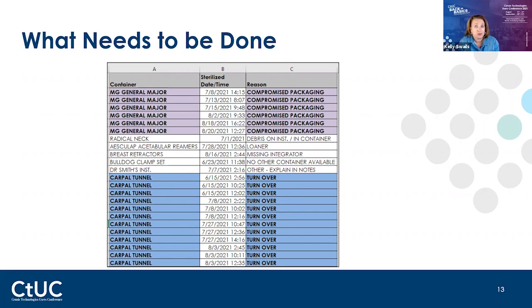But back then you could flash all you wanted to, and it wasn't an issue. And then when Joint Commission put that on the radar, that made big changes. And it's not like we thought we were doing anything wrong. It was just a different way of doing it. So like I said, it can be done. It's just a matter of identifying and then working with your leadership to identify what's there and then address and get those things.